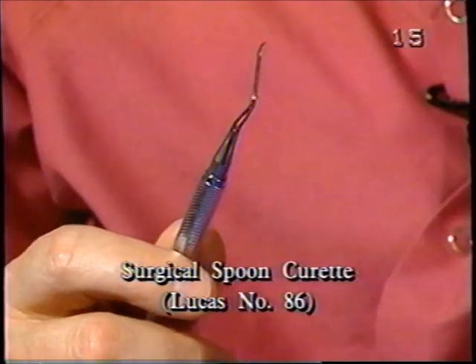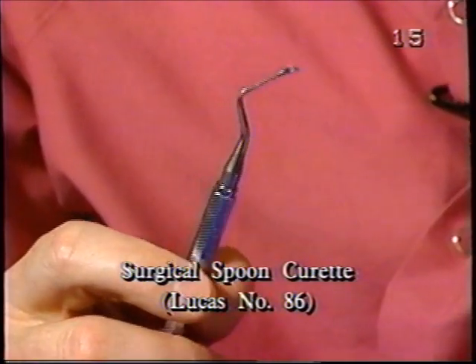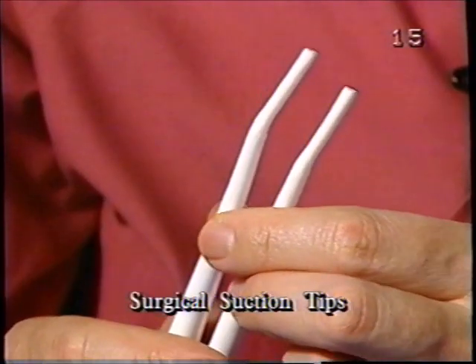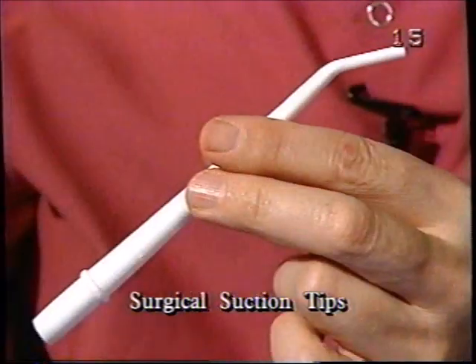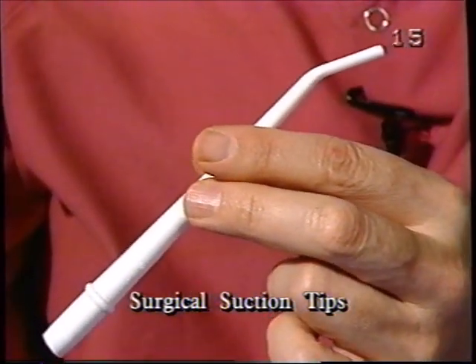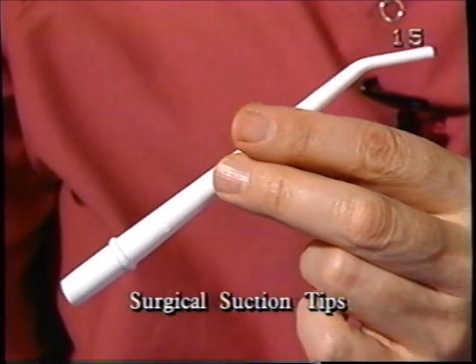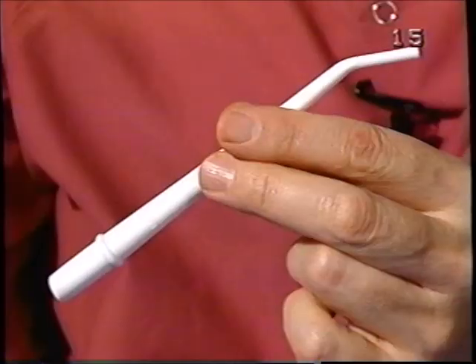This is a surgical spoon curette. This particular one is the Lucas 86. Now we have a couple suction tips. This one's tapered, and as a result it doesn't plug up as much as those that are not tapered. They're very inexpensive, they're autoclavable.